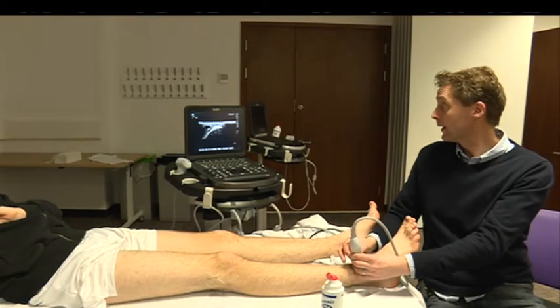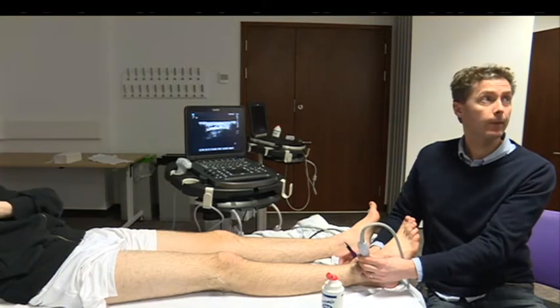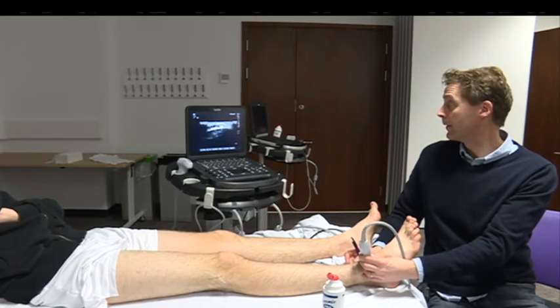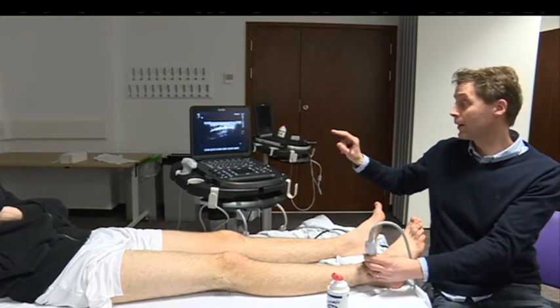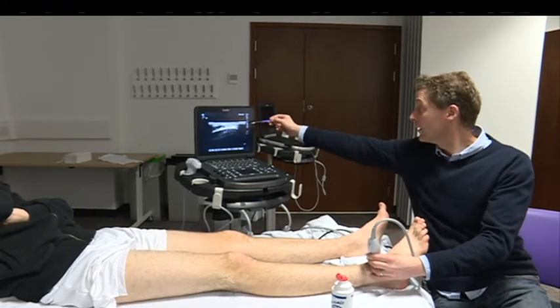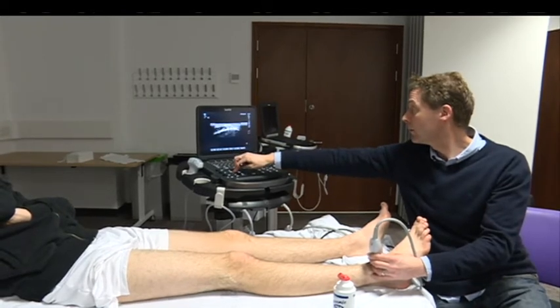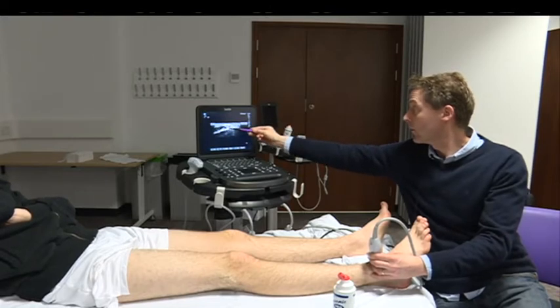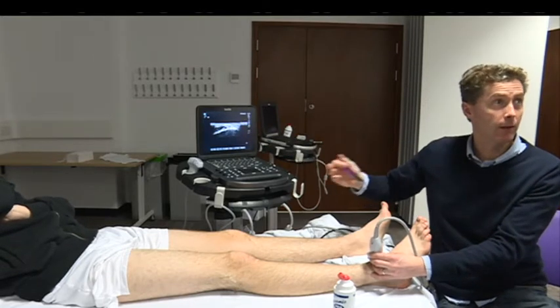The nerve is variable in position — sometimes medial, sometimes lateral, depending on where you're scanning. This level shows a classic characteristic appearance, but it is variable. Reducing the depth, you can see the nerve is about a millimetre across — a tiny little peripheral sensory nerve — so its position varies.